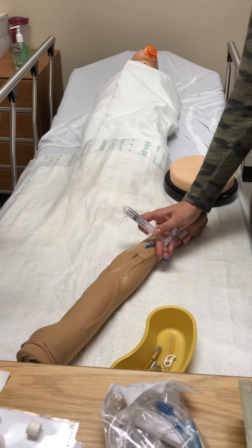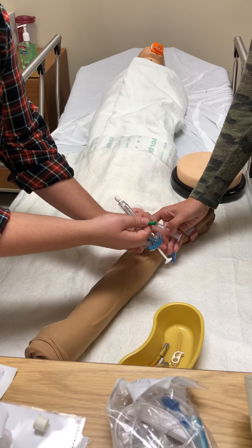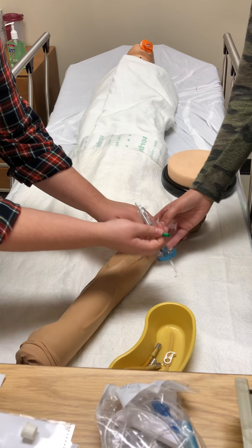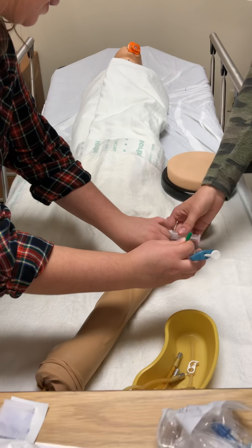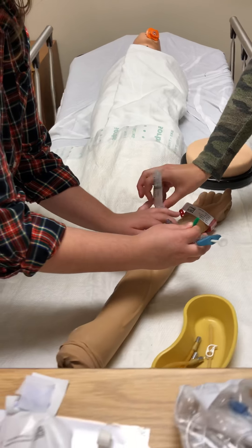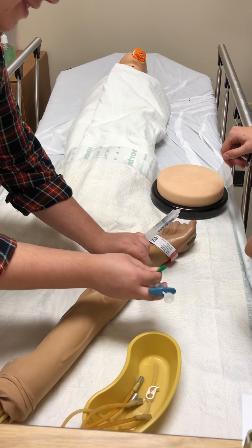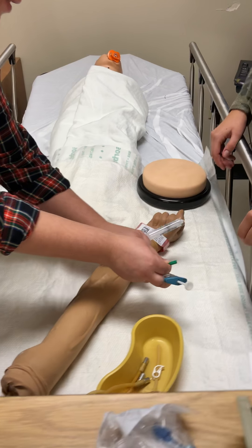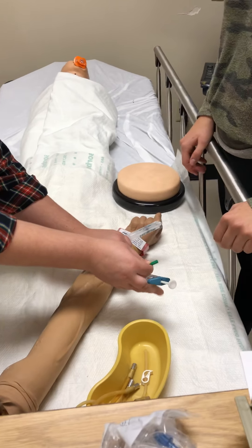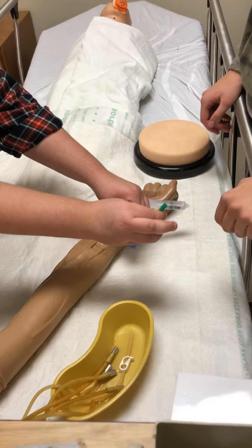And if it falls, you would just have to clean it again? For the port — if something happened, you would have to clean it again before doing anything else. For the saline, you may get a new one, but for the port you can just clean it again. You might just bring a whole bunch of alcohol pads just in case, or keep them on the table right there. You would administer it over a certain period of time — I think it's going to be seconds.